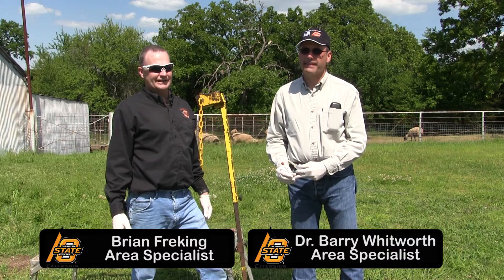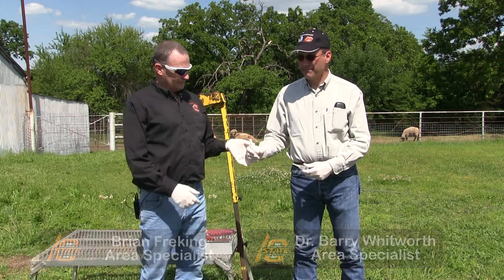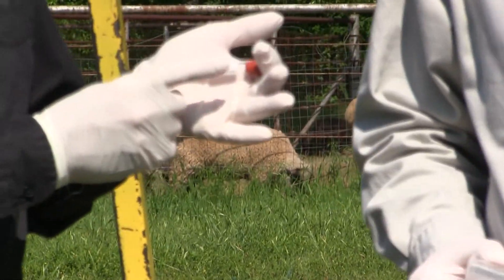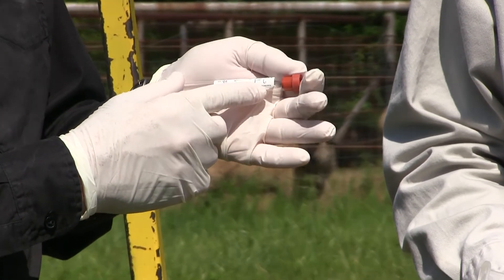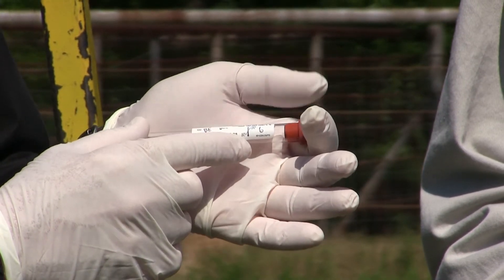The equipment we need for this is an actual blood tube. We want to make sure we mark the individual animal — in this case with a letter and the tube number. This is the sixth one we've actually sampled today.